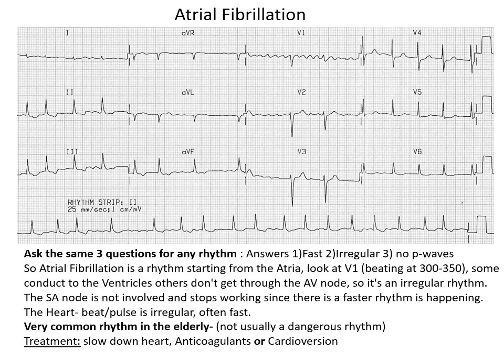And we're just getting different views of the heart. So time would be on the x-axis. And so time is on the x-axis, and we're just seeing the beats occur, or the electrical activity occur, in different leads of the heart. That's it. So let's look at this one briefly to see if we can figure out a couple of questions.